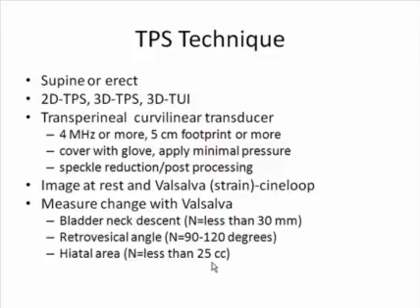It can be performed in the supine or, in fact, in the erect position, which is more physiologic, I might add. It can be performed with 2D, 3D, and there's something called tomographic ultrasound imaging, which I can clarify further in another slide coming up. So we put the glove over the transvaginal or the transperineal approach probe.